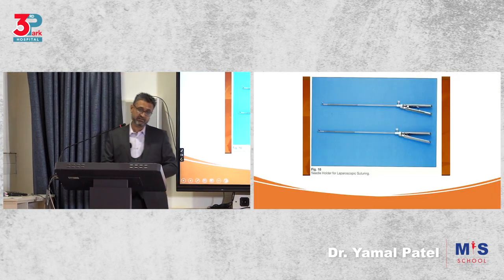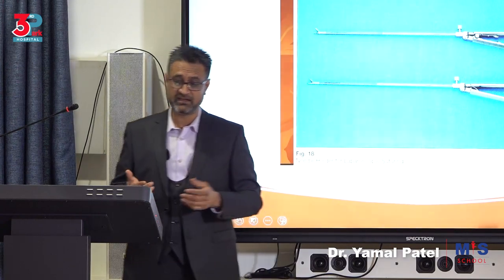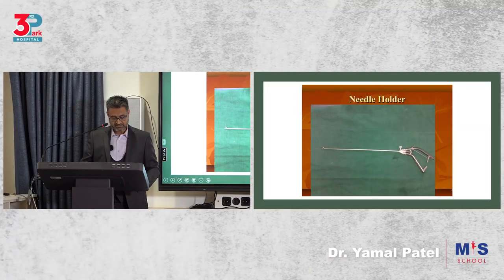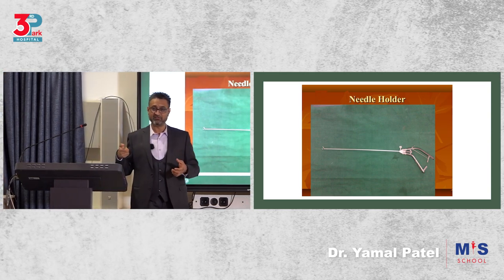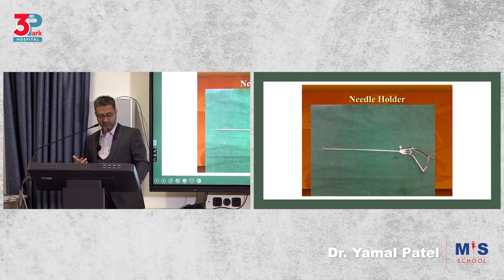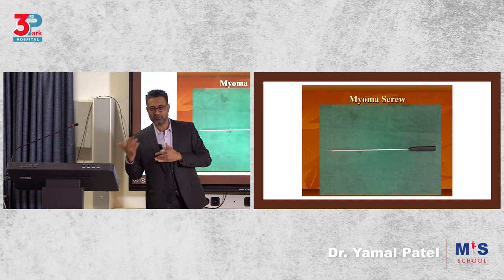Needle holders, obviously, are one of the things that we are going to try and focus on in this training, on the suturing, and we're going to have hands-on training on endo trainers about laparoscopic suturing. So for that, we need to know and work with the needle holders. There are different grips, a pistol grip like this one or a straight inline grip. It depends on which type of positioning you have. Are you doing ipsilateral or contralateral suturing?